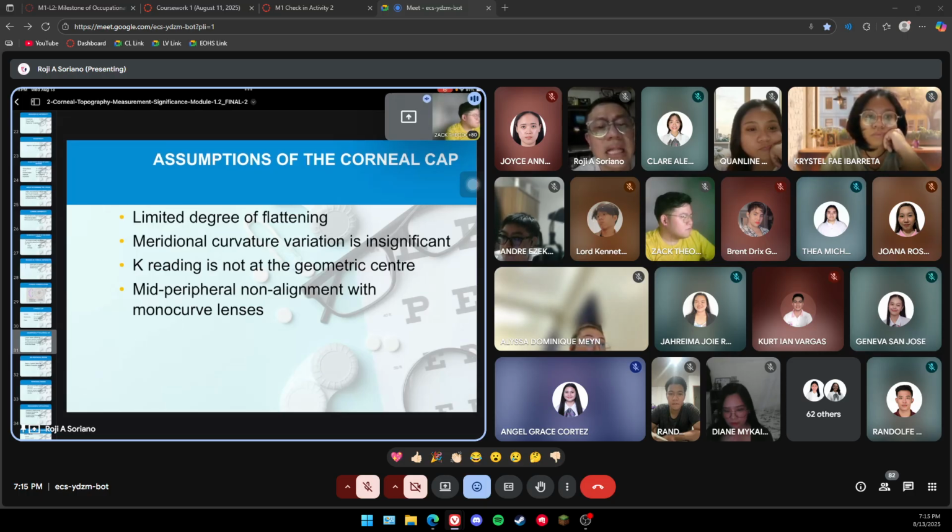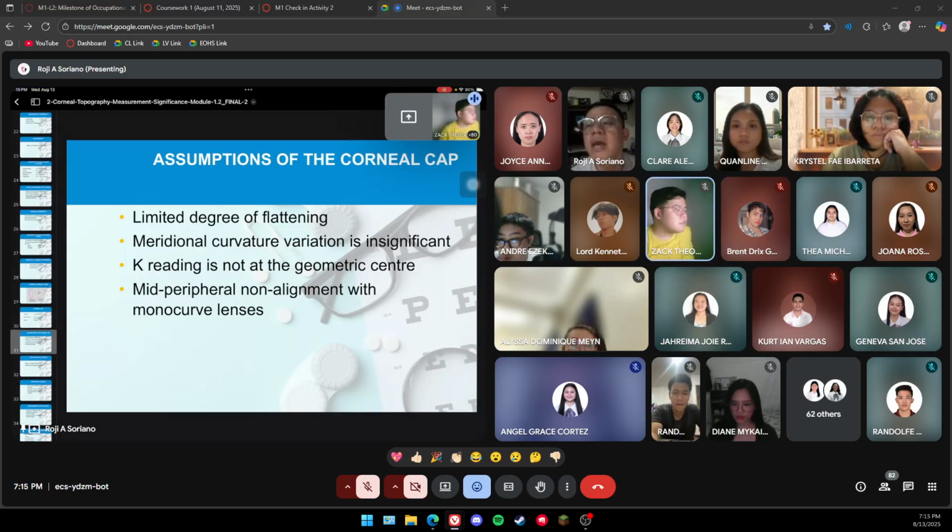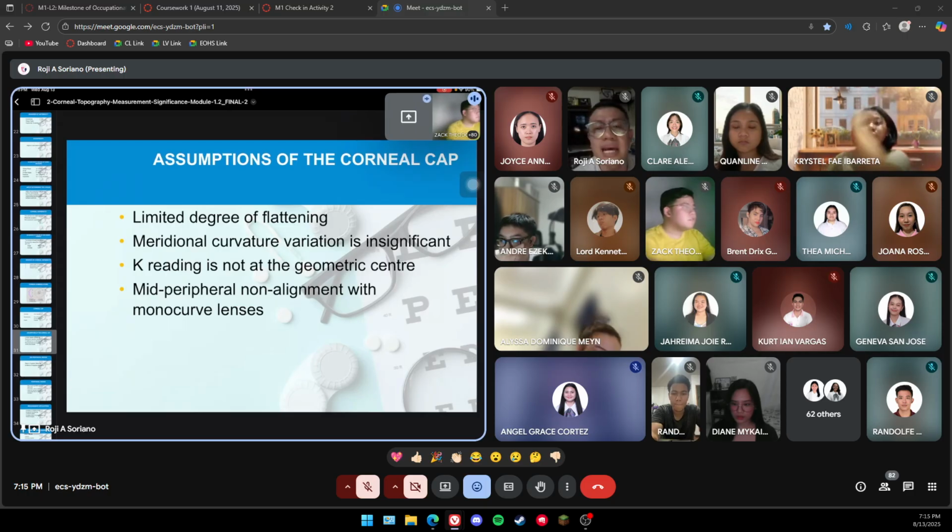And K reading is not at the geometric center, the mid peripheral, because we already understand that we are decentered. Where's the decentration again? Let me see if you remember. Nasally and superiorly. Very good. That's normal. It is normal to be decentered, okay? Very good.